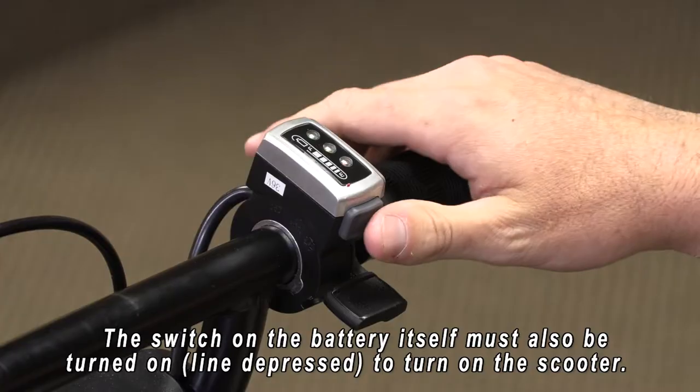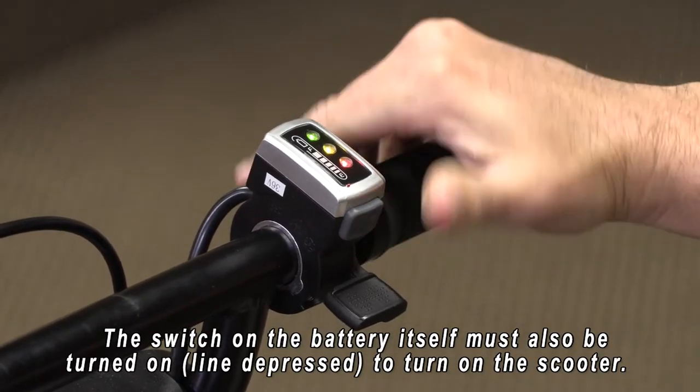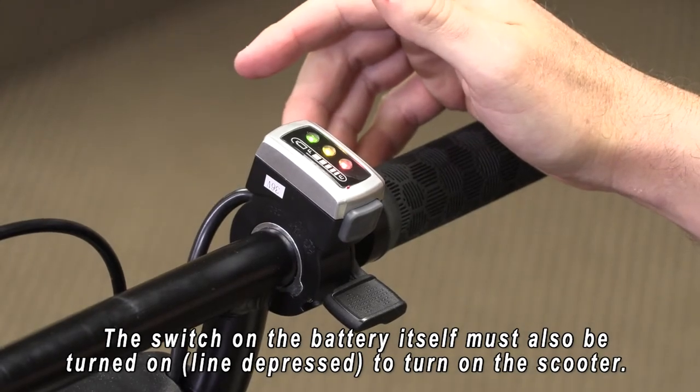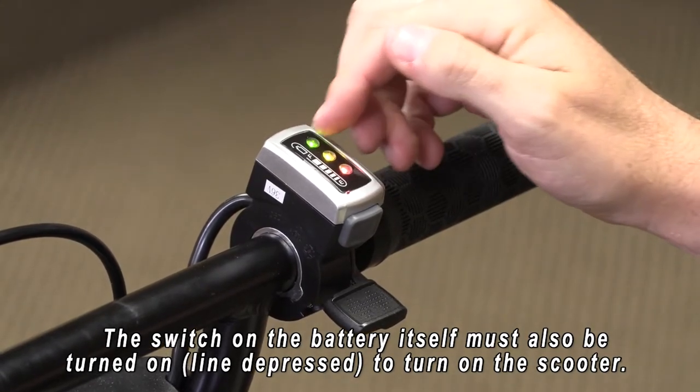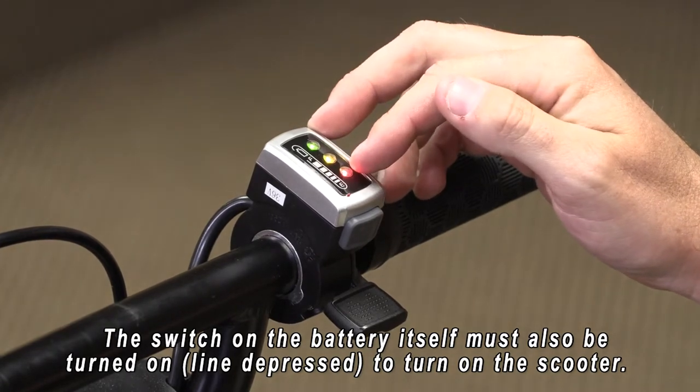Now I'm going to show you the operational controls on our dashboard. First on your right is a grey button that you'll depress with a small push — that turns your Glyon on. You'll see your battery indicators: green, yellow, and red. Green being full battery, yellow medium, red running out of power.